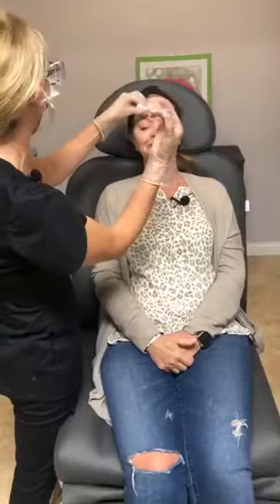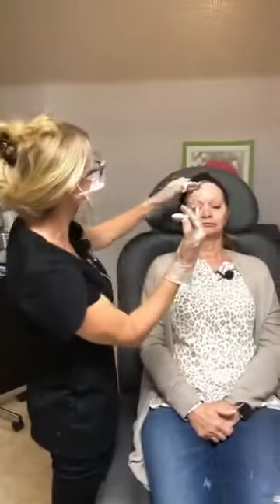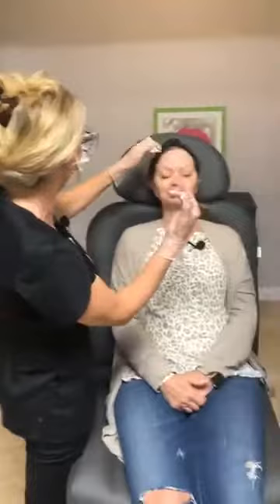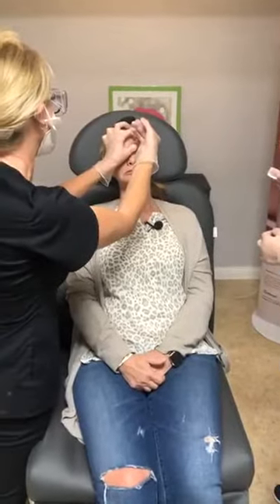I barely put anything in. I know. So with Botox, you have the chance of drooping. We've done her forehead in the past, but almost every time she's a drooper. Even the minimal amount will set her off. So again, that's why we don't do a whole lot. And it can happen.